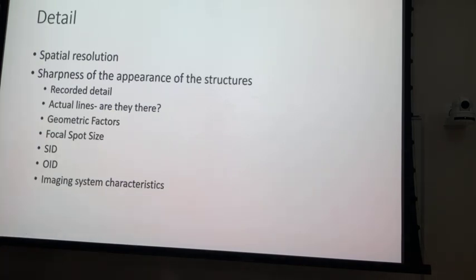Your monitors are fundamentally no different than this one, okay? And this one's good for reading stuff off of, but it's not good for making a diagnosis, right? So you make an exposure, and we kind of talked about window and leveling, or was that sophomores? Window and leveling, changing your contrast and density on your image, right?